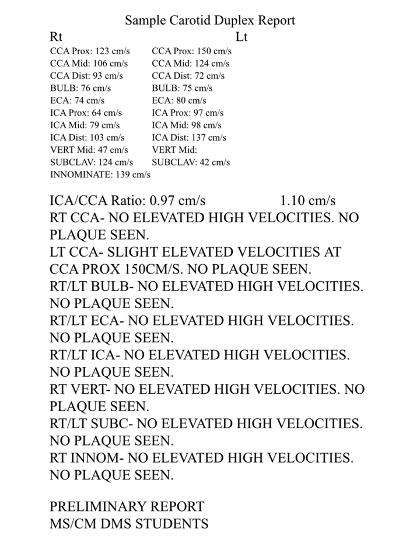You should also include if any elevated velocities were seen, if there was any plaque within the vessels. And you can see there at the bottom, Myra separated each vessel and documented that she saw no elevated velocities and a slightly elevated left CCA. Anything above 125 is considered an elevated velocity. And for each, no plaque seen throughout.